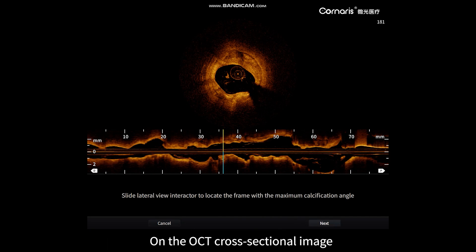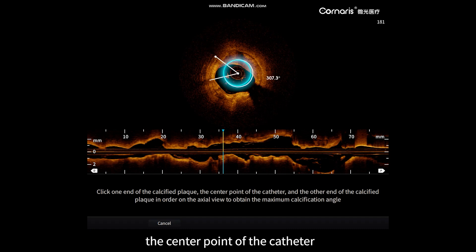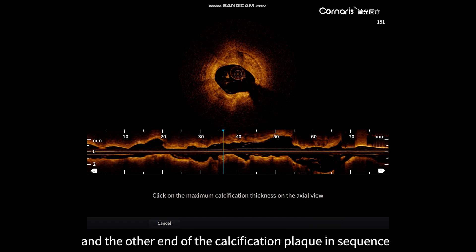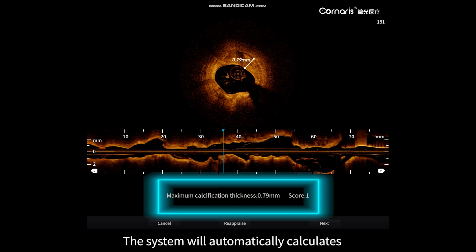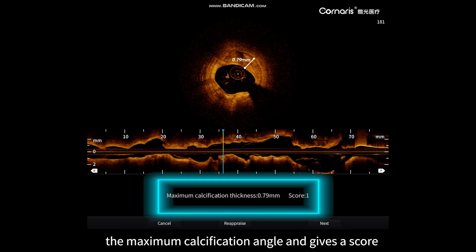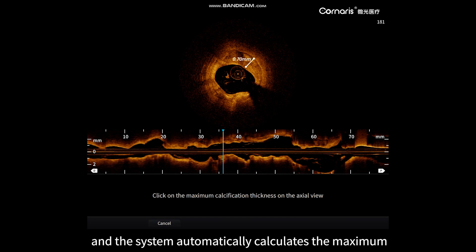On the OCT cross-sectional image, click on one end of the calcification plaque, the center point of the catheter, and the other end of the calcification plaque in sequence. The system will automatically calculate the maximum calcification angle and give a score. Step two: click on the maximum calcification thickness on the cross-section and the system automatically calculates the maximum calcification thickness and gives a score.